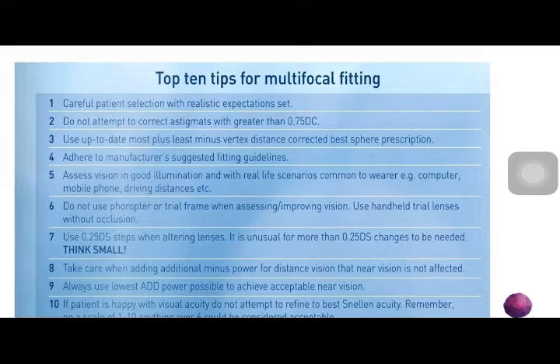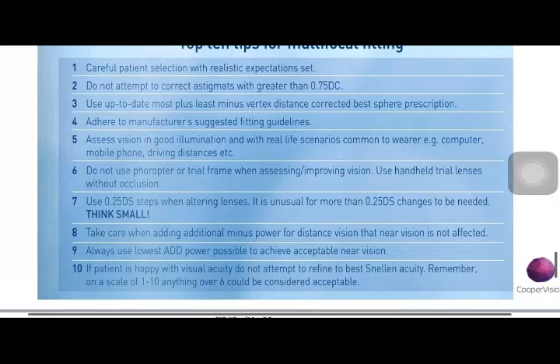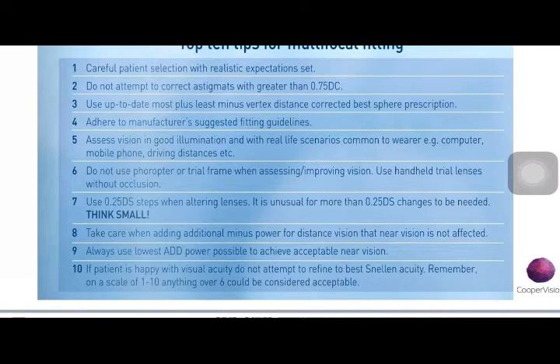And if your patient is happy with the visual acuity, that means if your patient is happy with the functional vision, then do not try to correct 6x6. If your patient is happy with the functional vision, they don't have a problem with the contrast sensitivity and they're happy, go ahead and dispense the lenses to them. And remember that a few of the times the vision will become better after a few days. So these are the top 10 multifocal fitting guides that you should always remember.